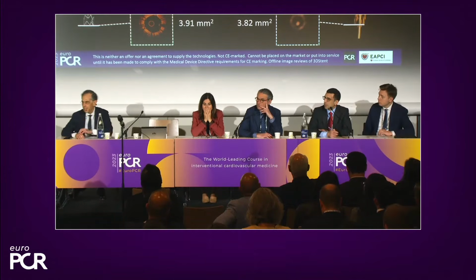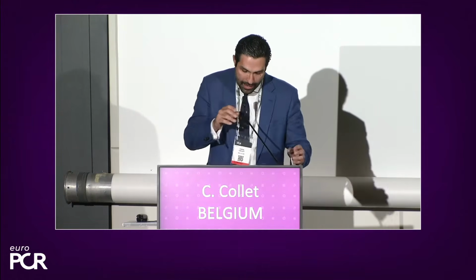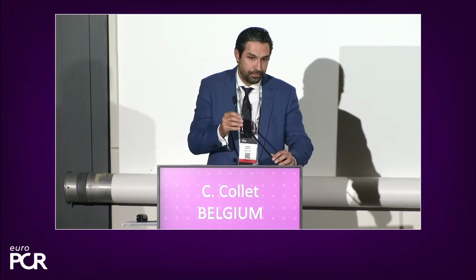Well, I think that we have done a few patients, and one of those patients was really a patient with a BMI above 35. And the quality of the image that you obtain is suboptimal for quantification. Okay? So I think this technology is very useful, but it has this limitation of BMI, which I think is something that we also live with conventional angiography in various obese patients. So this is going to serve for a large population of PCI, but not for everybody, and we have to keep that in mind.